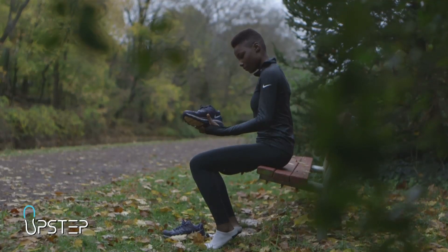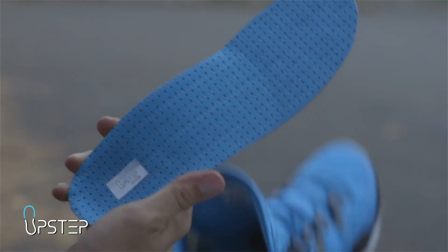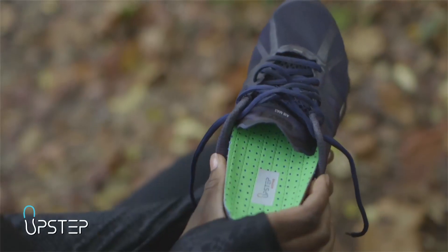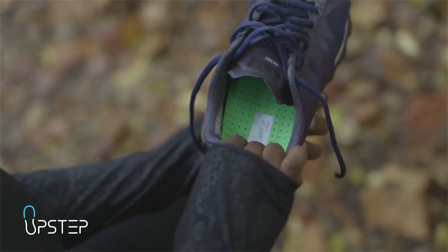For full-length orthotics, first remove your shoe linings if your shoes have a removable lining. Place your orthotics inside your shoes and be sure the orthotics start from the edge of the heel. Put your hand inside the shoe to make sure the orthotics sits correctly from the edge of the heel to the toes.